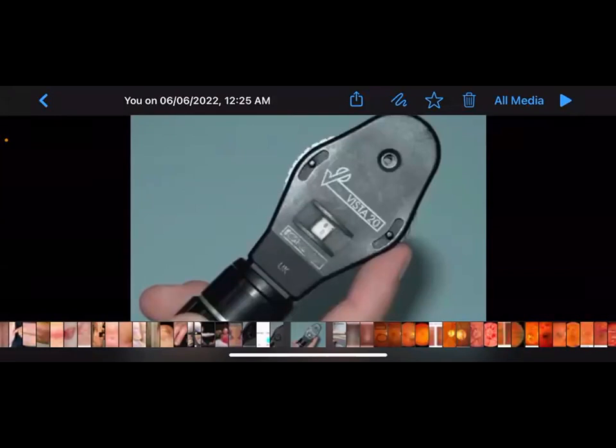So make sure before you go to the exam, if you wear an eyeglass, you have to know, is your problem far vision or near vision, okay? If it is far vision, you will need to choose positive focus. If it is near vision, you will need to choose negative focus, okay? And try to know your focus before going to the exam.